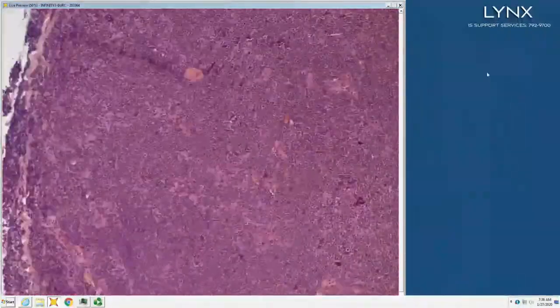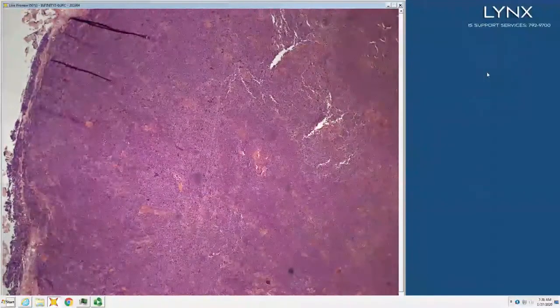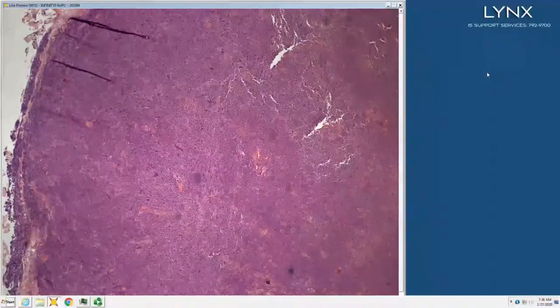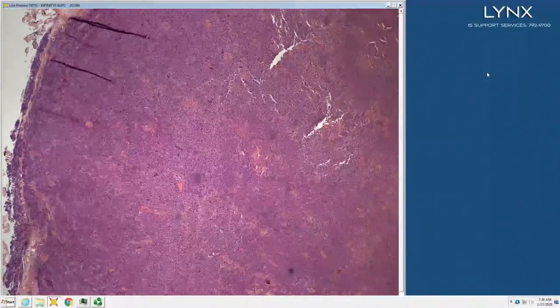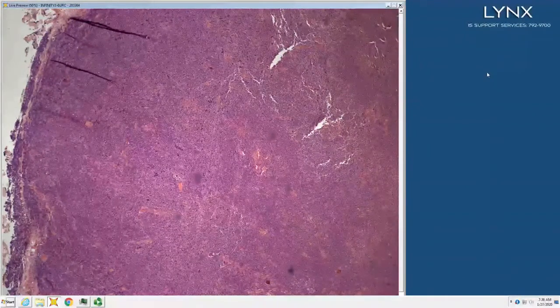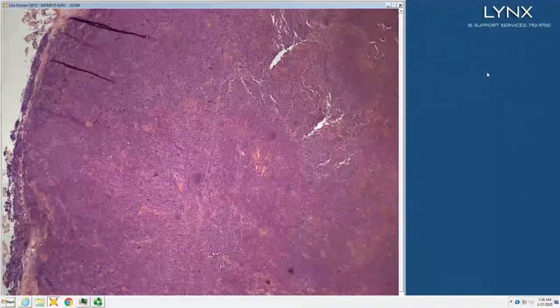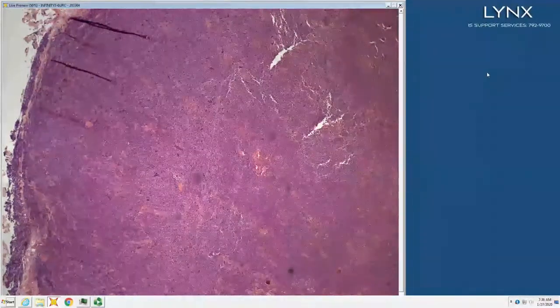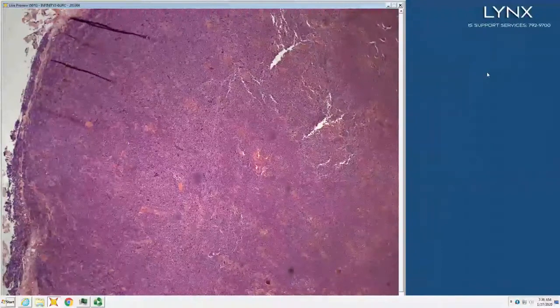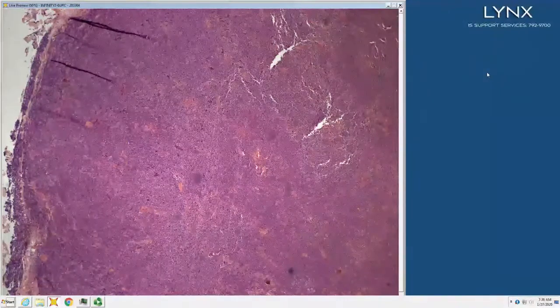So then once you get that far, is this a follicular pattern or a diffuse pattern? Diffuse, right? You're not seeing things that look like germinal centers with cells around them, right? We'll get to marginal zone in a second, but let's finish this. So this is a diffuse pattern. Diffuse patterns are commonly follicle center type phenotype when they're cutaneous.